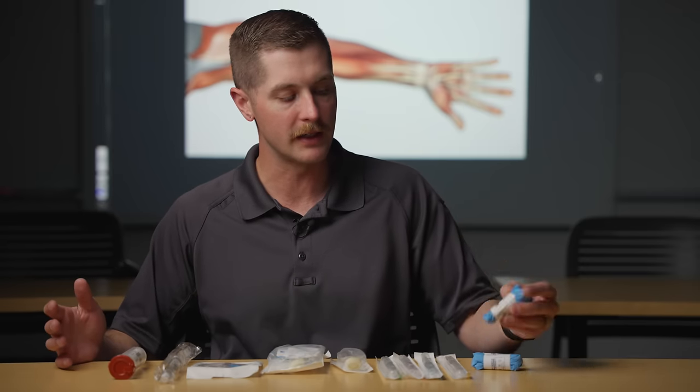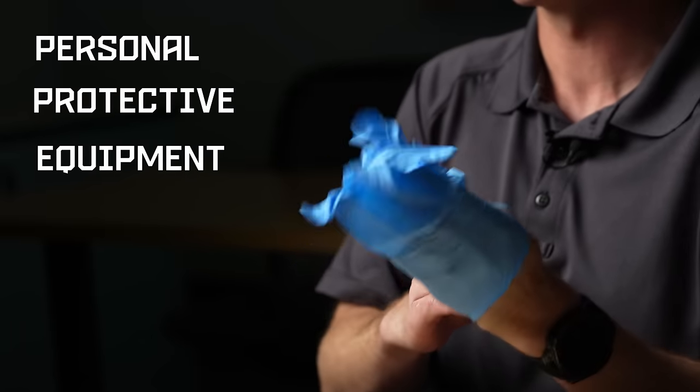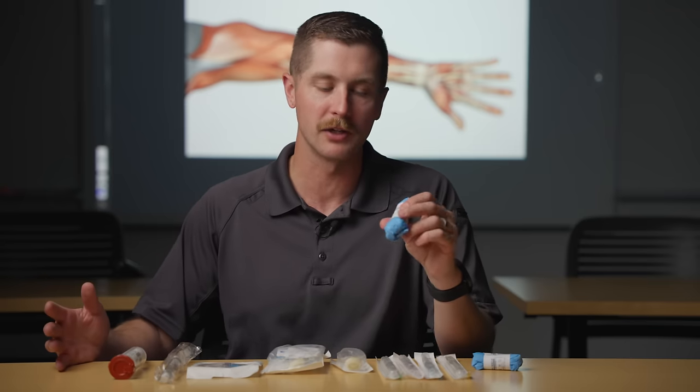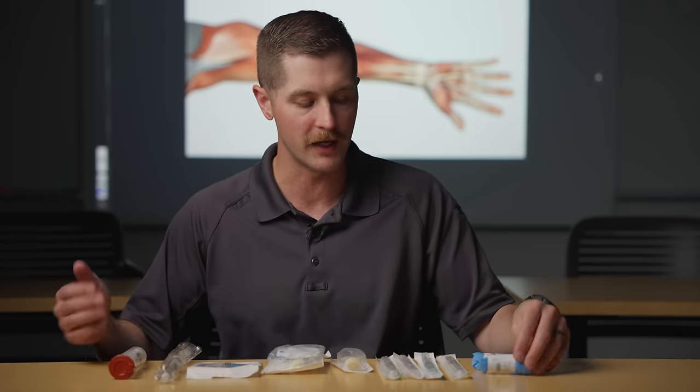The first thing you're going to need is some kind of PPE — personal protective equipment. These are gloves. Now these gloves do not have to be sterile. This is not a sterile procedure, it's just something that has to be aseptic. We want to keep it as clean as possible and this is just as much for my protection as it is for the patient's protection.